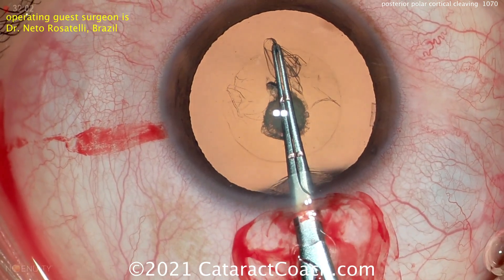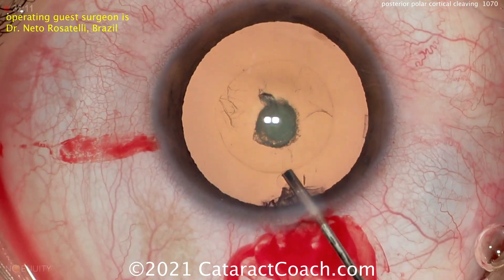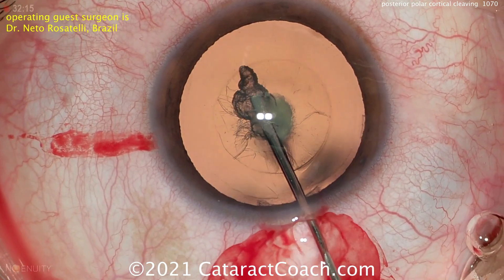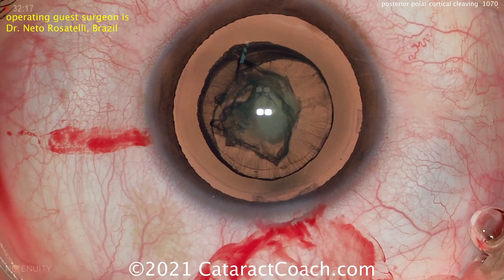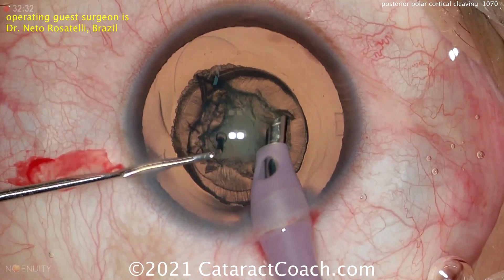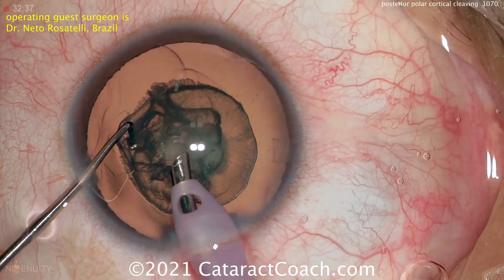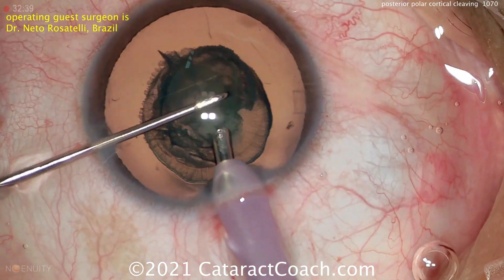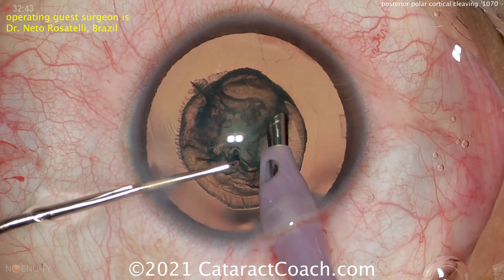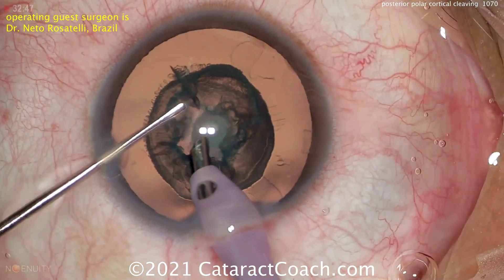A beautiful rhexis, exactly five millimeters — we expect nothing less from a master surgeon like Dr. Rosatelli. Now, hydro delineation of just the central endonucleus. Notice that we've done zero hydrodissection. That's the risky step for a posterior polar.